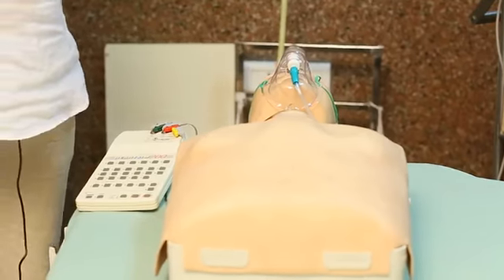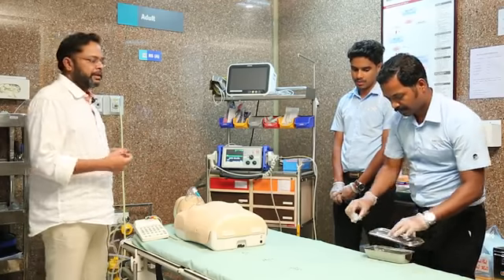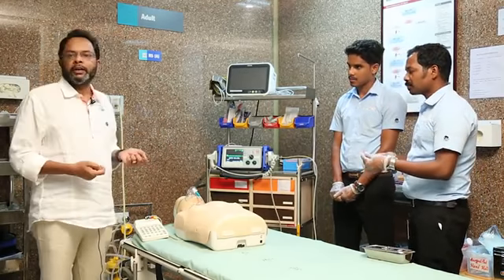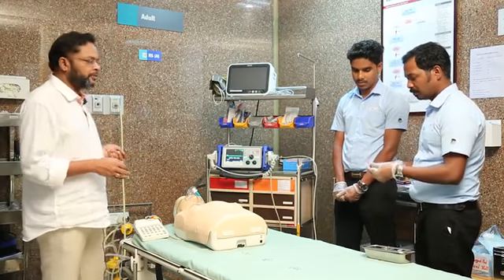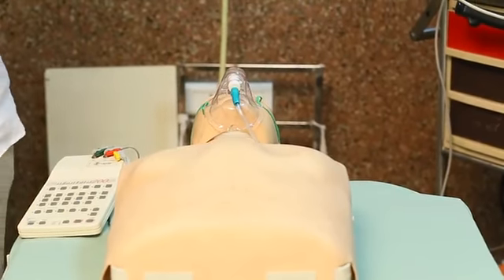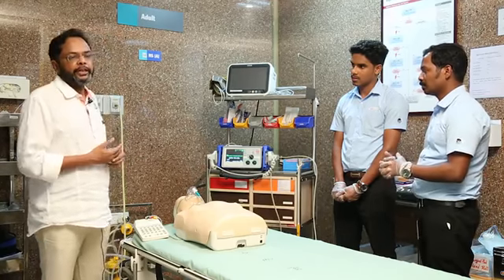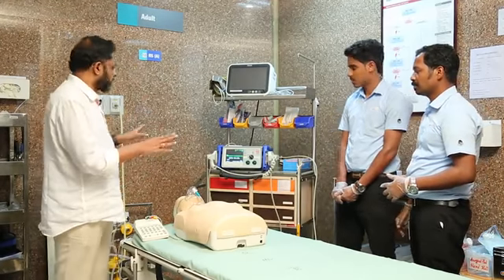Then we have to give a certain amount of sedation, because passing a current into someone's body is painful and will cause a lot of discomfort. So we have to give adequate sedation, either midazolam or an opioid, anything we can use depending upon your institution policy. Once this is done, we will move for the cardioversion.